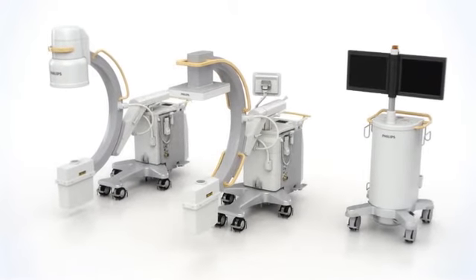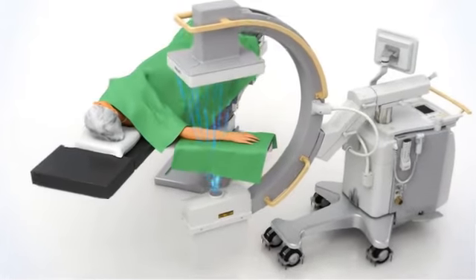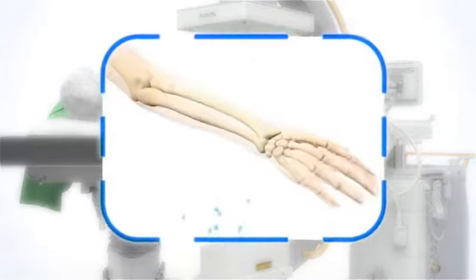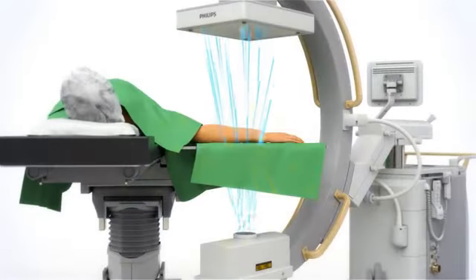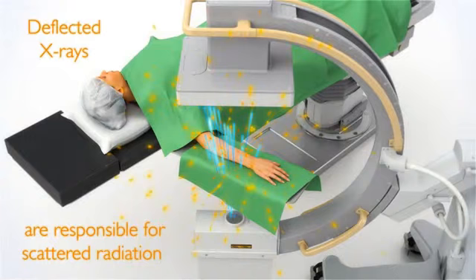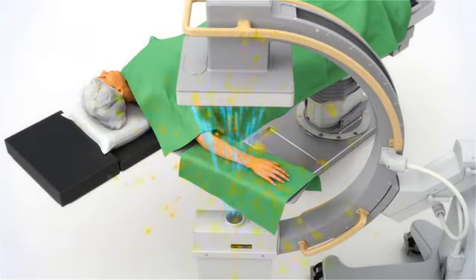The quality of the image that is created depends on the type and amount of X-rays that pass through the human tissue. As the X-rays travel through the patient, some are totally absorbed, some are deflected, and others pass through unaffected. It is the deflected X-rays which are responsible for what is called scattered radiation. This forms the exposure to the staff.